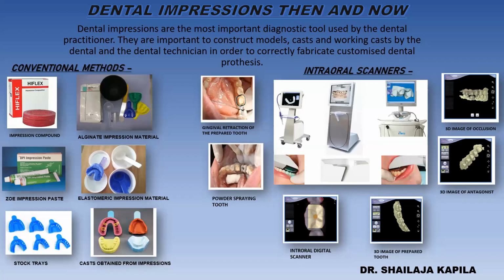After the scan of the prepared tooth is completed, spraying and scanning of the antagonist can begin in the same manner. Eventually, a patient's buccal side scan at oral occlusion is taken to acquire a bite record. The final digital file output from the scan system is transmitted to the technician for further CAD/CAM process or applied for chairside design and manufacturing.